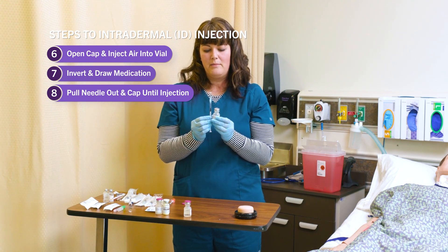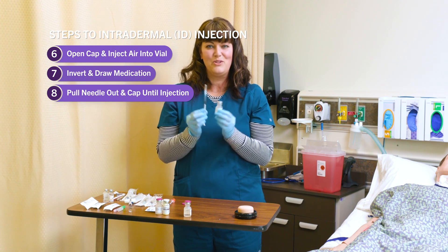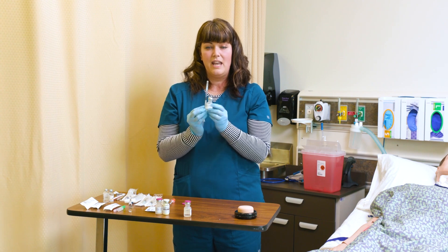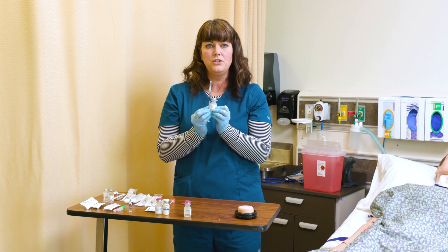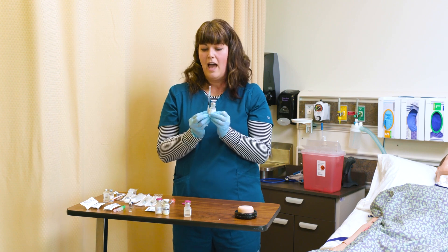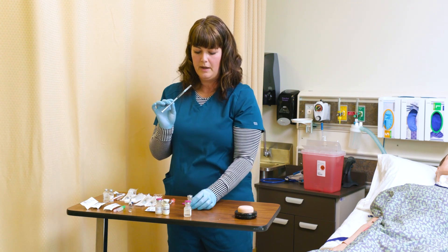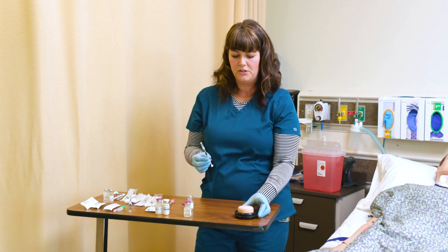Another tip: when you draw up medication into a syringe, make sure to label it. You either tape the vial of medication right to your syringe or have it labeled on the wrapper in some way so you know what is in this syringe.